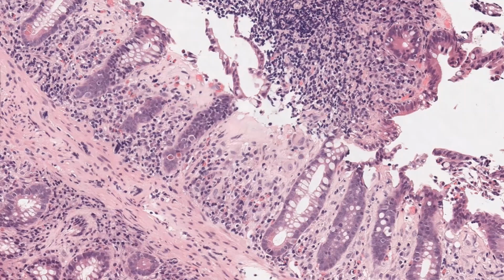We saw increased inflammation, yes. In this case in particular, if I start counting, but I don't have the time, mainly in the surface epithelium, you will be able to see slightly that the intraepithelial lymphocytes have increased. If I go into an area like here and start to count the number of lymphocytes, I might find them like 13, 14, 15. Anything above 10 usually means an increase in intraepithelial lymphocytes. But what is the difficulty for a case like this?